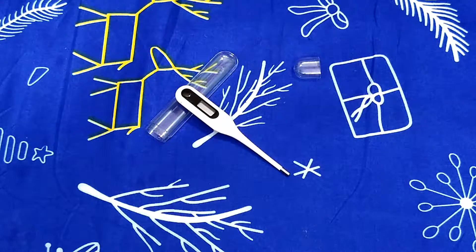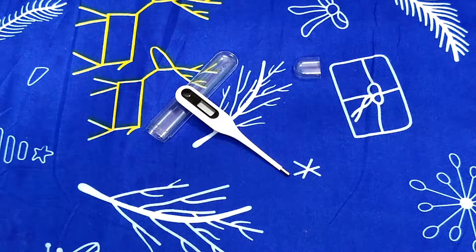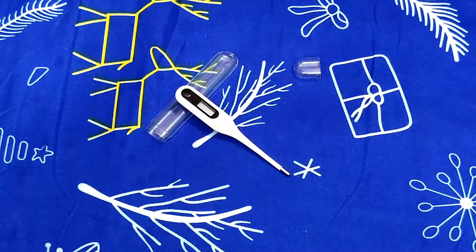Hello guys, welcome back to Dexion. In chilling winters we usually get cold, so in today's episode we are going to talk about the digital thermometer from Xiaomi Mi. Stay tuned and let's get started.